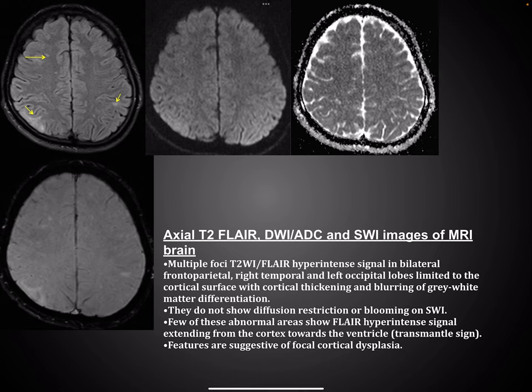Here is another case with axial T2 weighted FLAIR, diffusion weighted imaging and susceptibility weighted imaging of brain. Multiple foci of T2 FLAIR hyperintense signal in bilateral frontoparietal regions, right temporal and left occipital regions are noted, limited to the cortical surface with cortical thickening and blurring of grey-white matter differentiation. They do not show diffusion restriction or blooming. Few of these show FLAIR hyperintense signal extending from cortex towards the ventricle — the transmantle sign — features suggestive of focal cortical dysplasia.